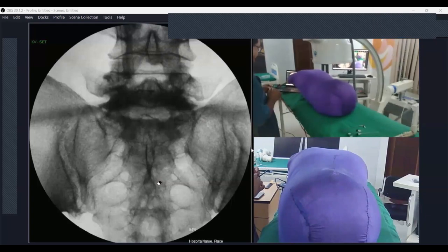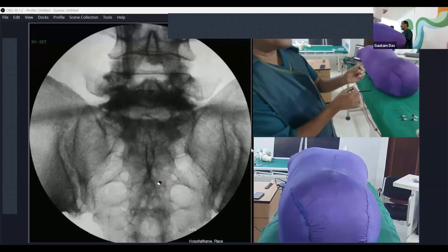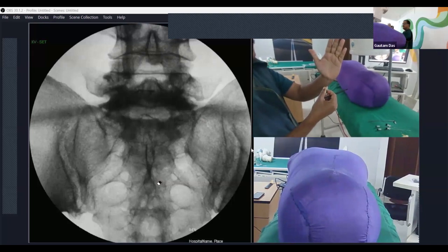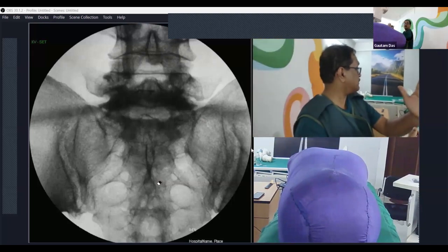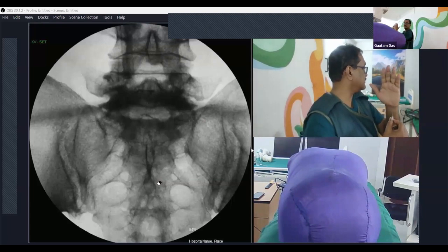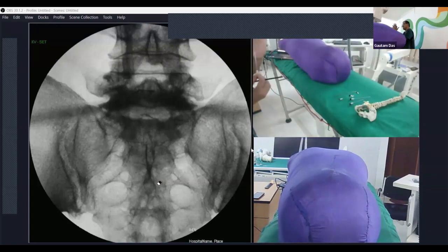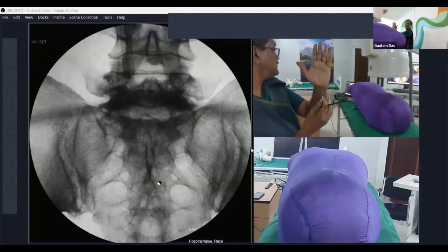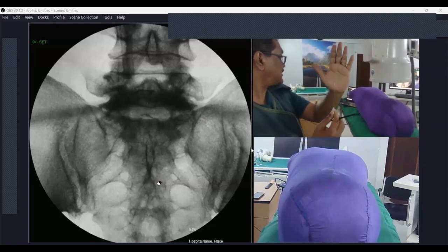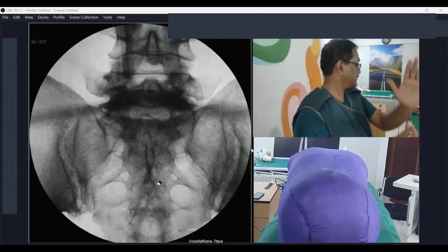Sir, please show one bent needle. Okay, in zoom. Can you see? The bend should not be very large. It should be around 3 to 5 degrees, not more than that. This needle is a little more bent. You see this here? Sir, it cannot be appreciated well.